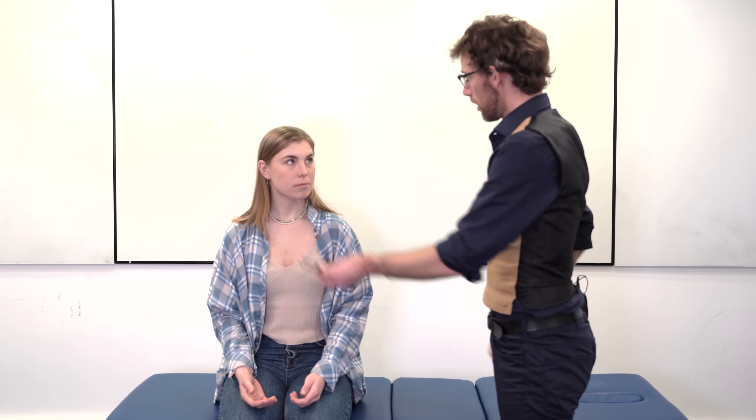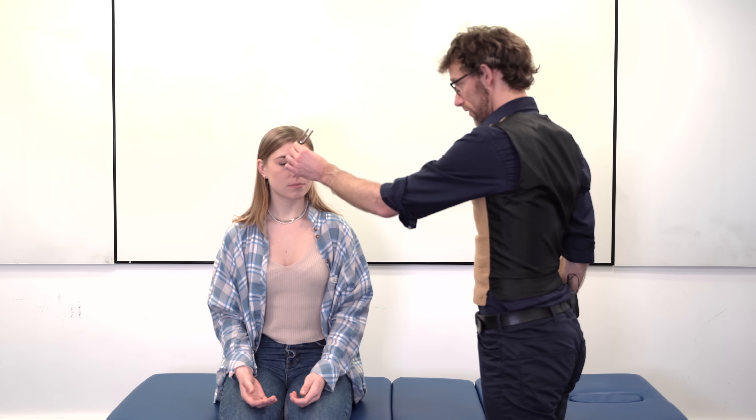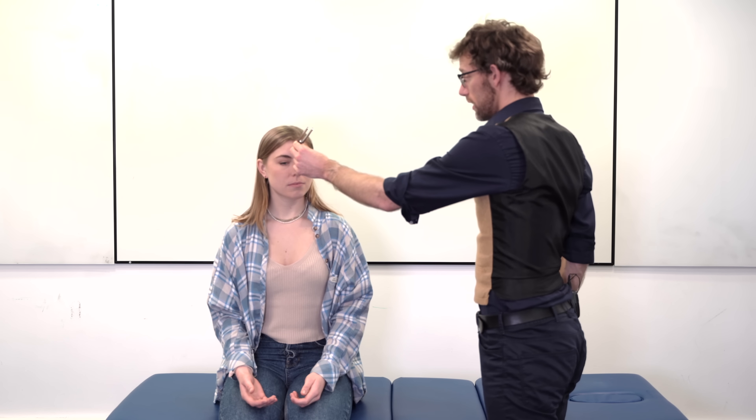I'm going to tap the fork and place it on your forehead. You can hear a noise in your head — which ear can you hear it in: the left, the right, or the centre? The centre. So that's fine — we've got a normal balance there.